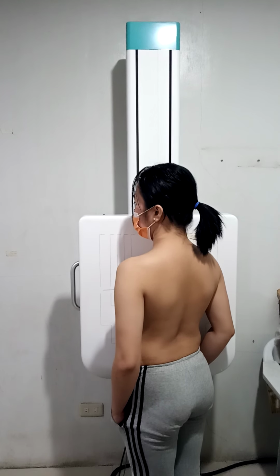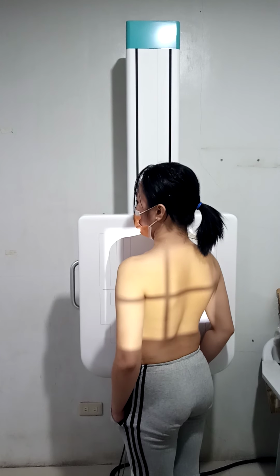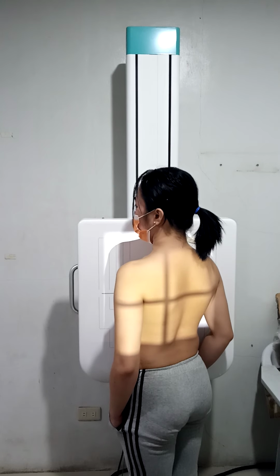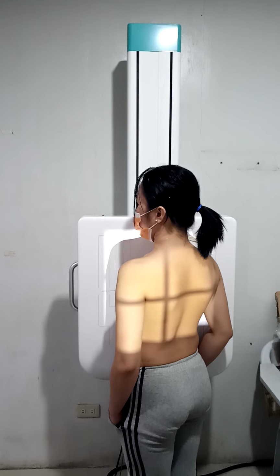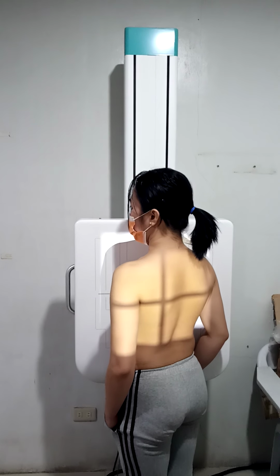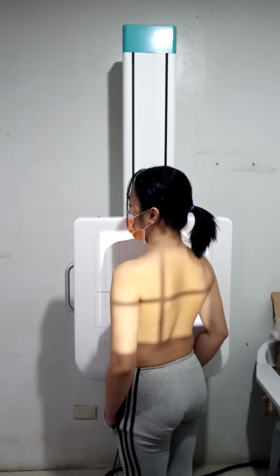The central ray must be perpendicular to thoracic 7, and the central ray enters the elevated side of the posterior thorax approximately 1 inch or 2.5 centimeters lateral to the mid-sagittal plane. Then the collimation must be 10 by 12 inches or 24 by 30 centimeters. Then place the side marker in the collimated exposure field.